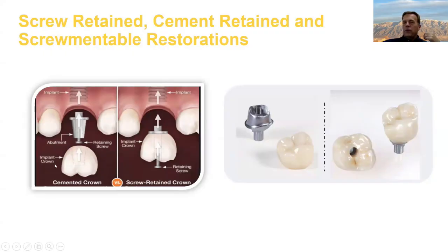All this, of course, is assuming that the implant is placed so that the screw hole can come out through the occlusion or through the lingual.